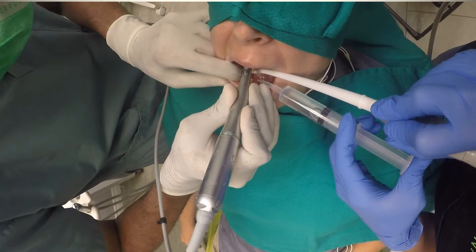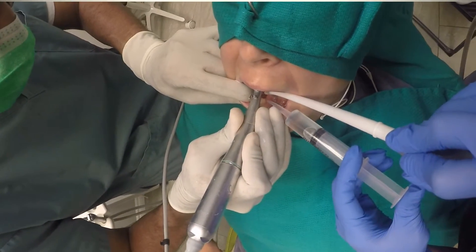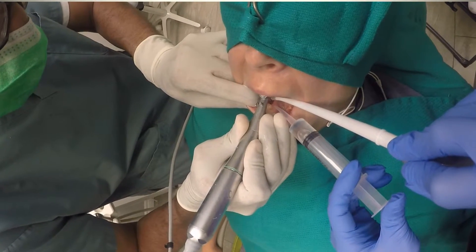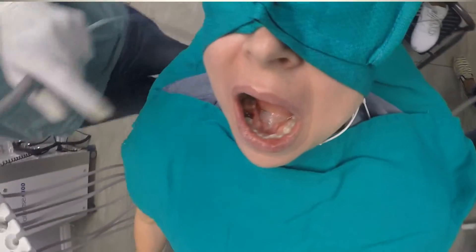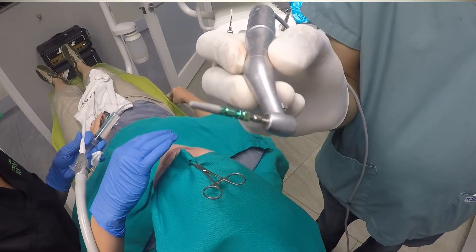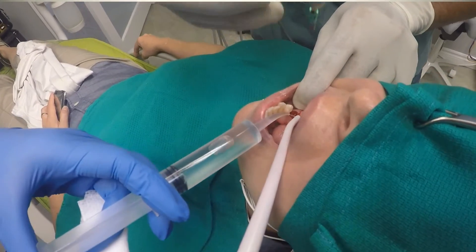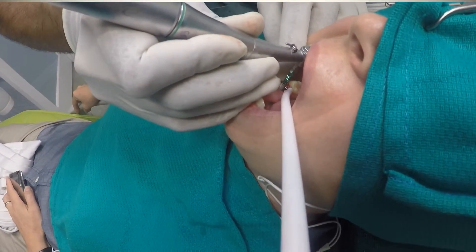You can see here I am completing my osteotomies by progressively going through the series of twist drills. In this case we are going to be placing a 3.7-millimeter implant. As previously described, 10 millimeters is the ideal length, giving us enough safety zone accounting for the drill-to-implant length difference of 0.5 millimeters and our calculated distance from the inferior alveolar nerve. There's the implant — I'm demonstrating what slow-speed implant dentistry looks like.